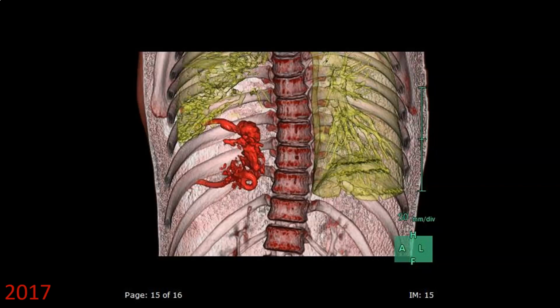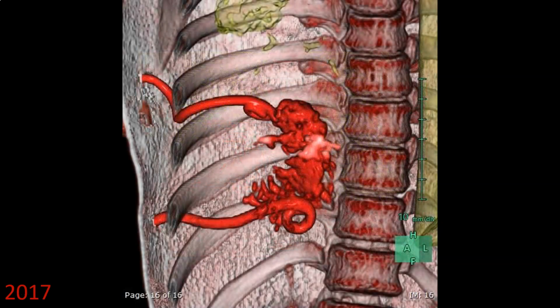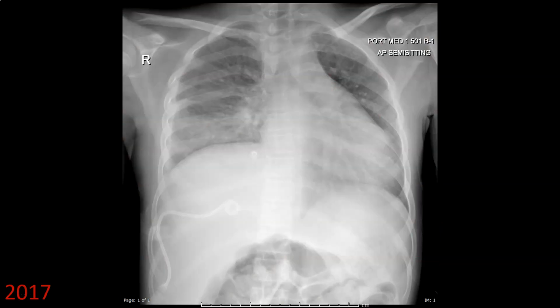What was done here is that contrast agent encoded in red has been injected in one of the draining catheters to see if the two abscesses in the lung and the liver are intercommunicating. They were intercommunicating. The lung abscess healed first.